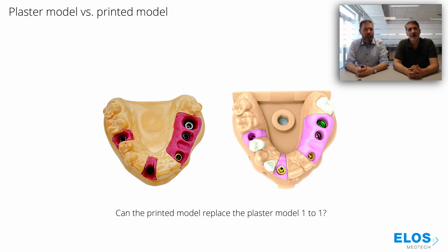Yes, because today still a big amount of models are made on the conventional process. And that's the plaster model. That's the plaster model. Yeah. And I think it's still, especially for implant model, it's still the benchmark in precision. Yes, even though you have a multi-step process chain with contraction of impression material, with expansion of plaster, with maybe limited access of the tray to the patient's mouth, with all this blood and saliva around.